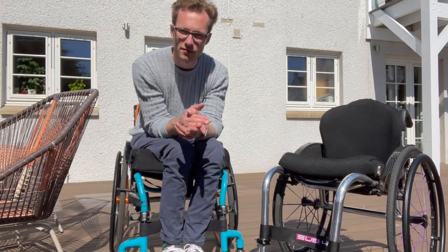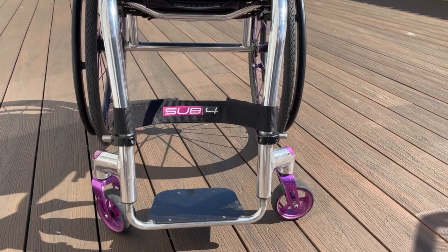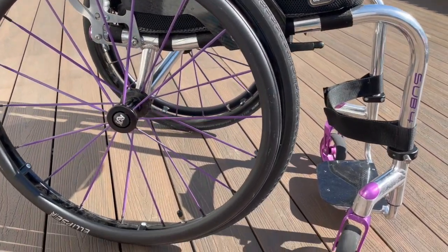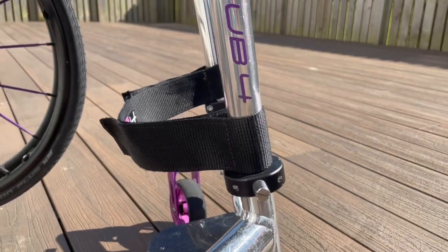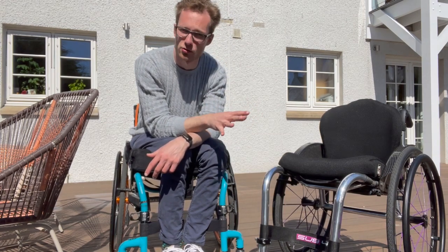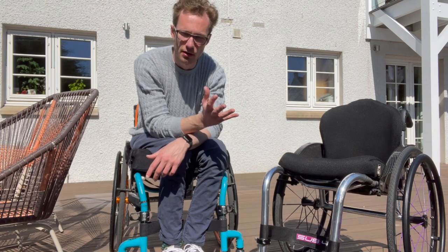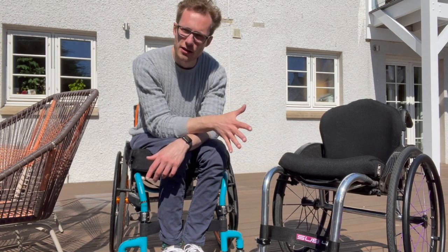Hi everyone, my name is Danny and in this video I'll be giving you a brief short-term review of the RGK TIGA Sub 4. The reason I'm giving this review is that there's actually not a lot of videos out there reviewing wheelchairs in general, and given that often there's such a significant cost outlay, you really need to do your research before buying one of these because it would be an expensive mistake to get wrong.